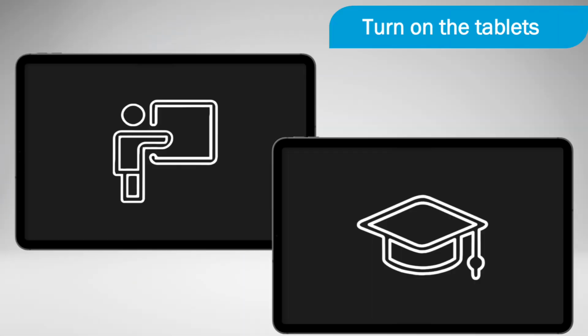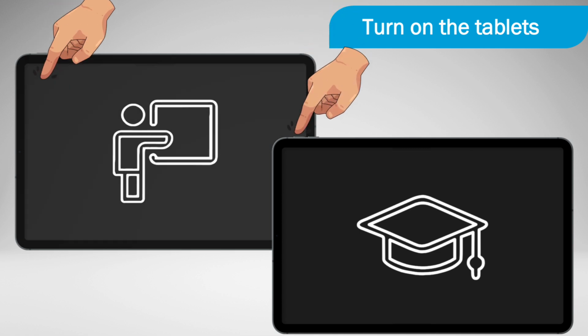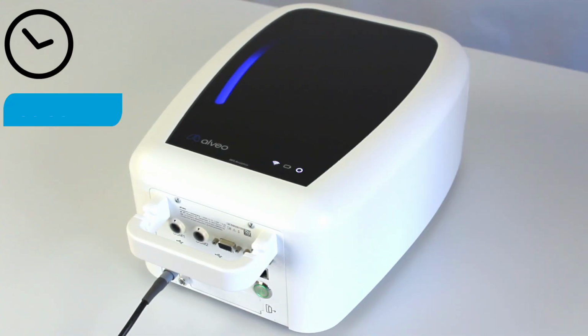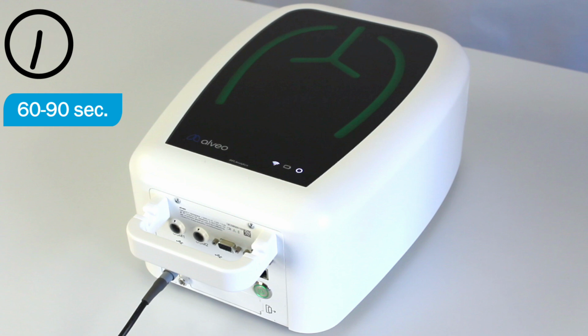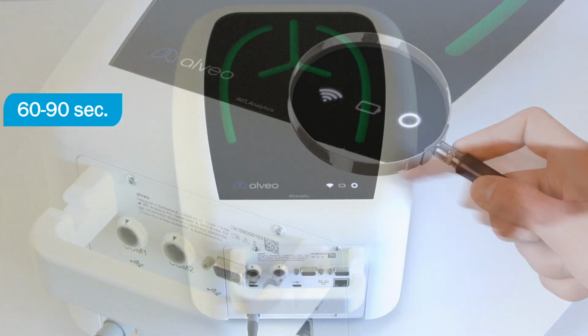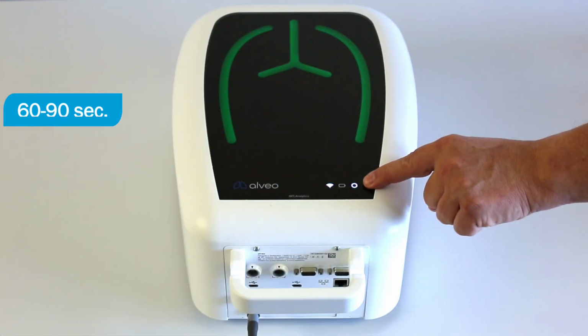Turn on both tablets. And wait until the alveo applications have fully loaded on each one. After about 60 to 90 seconds, alveo has fully initialized. If the status icons show no warnings and are displayed in white, the system has started up correctly.